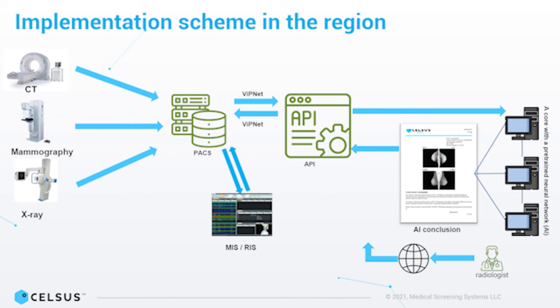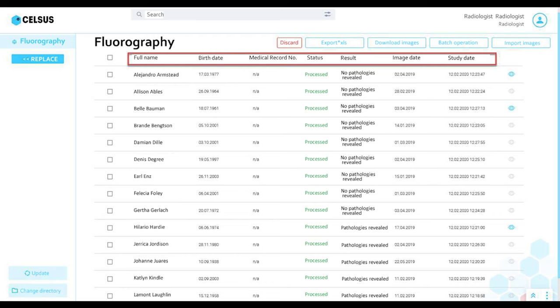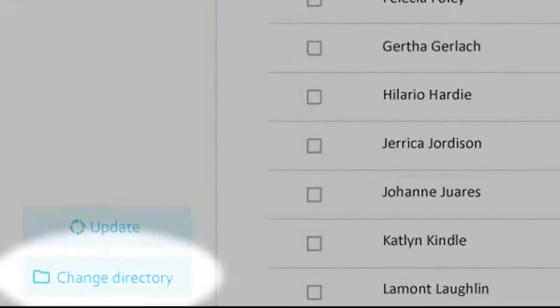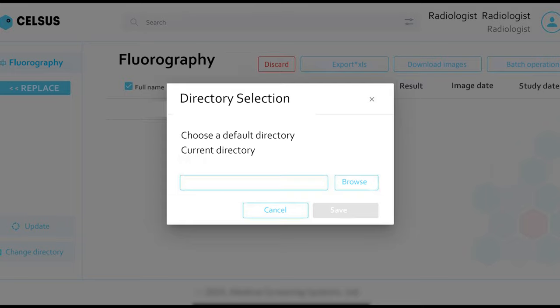The system is designed not to increase the load on the doctor, but to help him. As soon as the study enters the PACS system, Celsus performs a processing procedure. The doctor sees the result of the analysis in the familiar interface. To get started, let's go to the profile section of the system and select the study location directory.